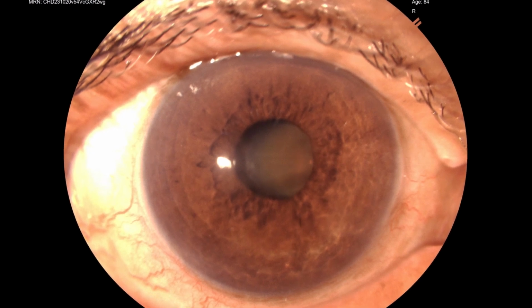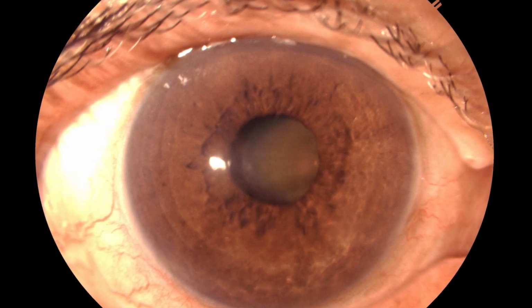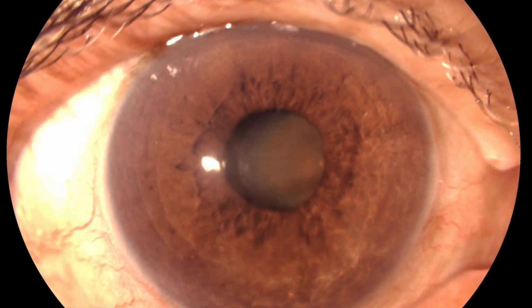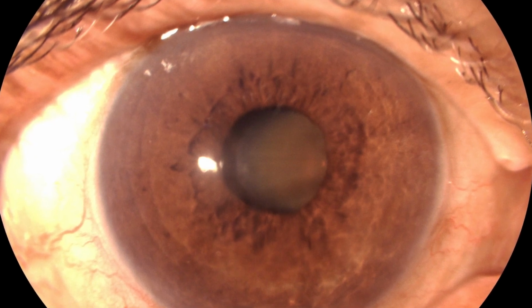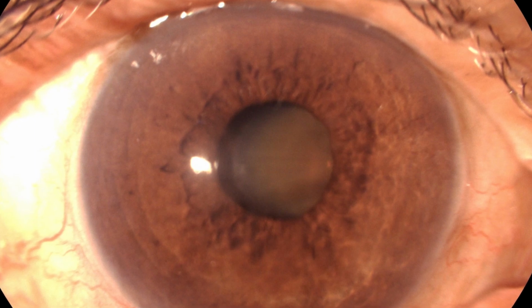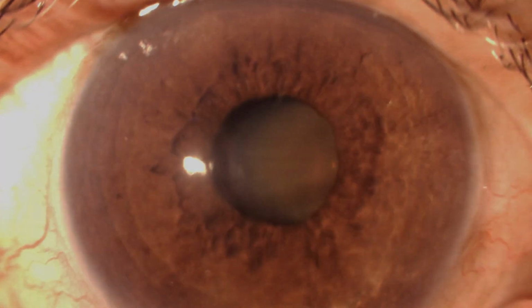Consistency is the key in surgical outcomes, and so is the case with the difficult cases which I operate. This is one individual who had a dense cataract along with a floppy iris, and as you can see, this is the kind of pupillary dilatation which we could achieve in the OPD.